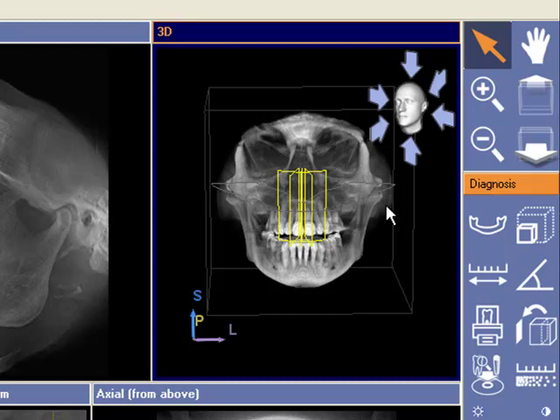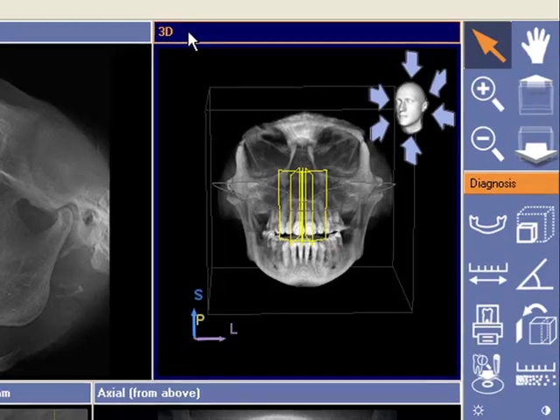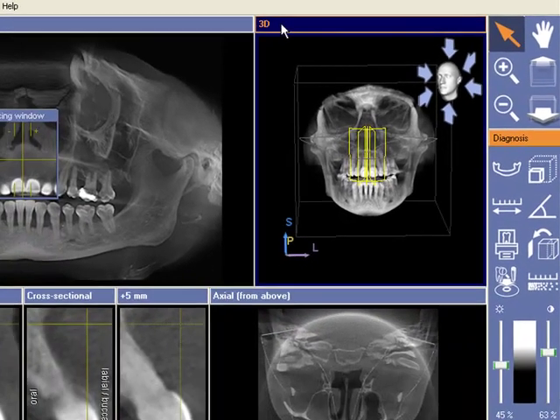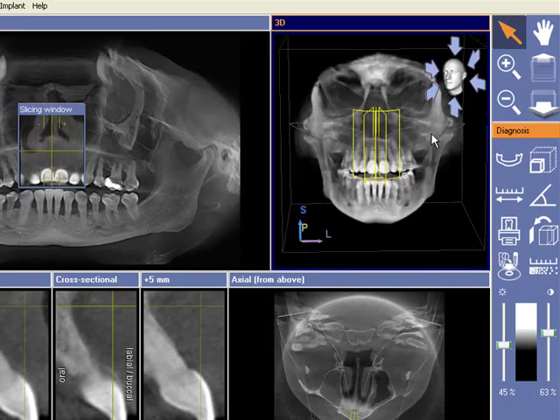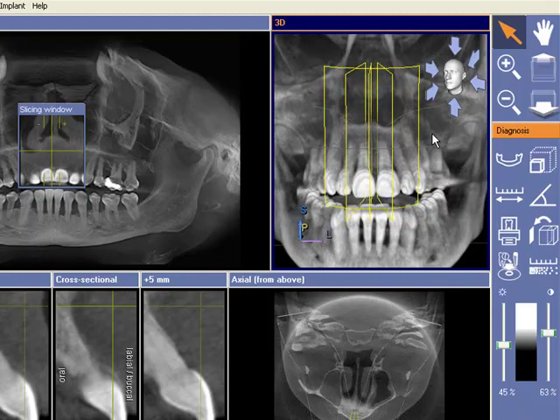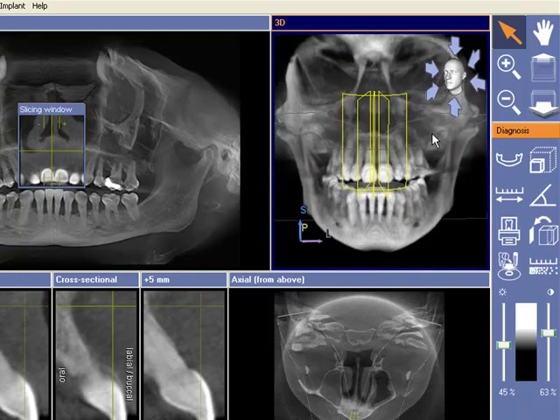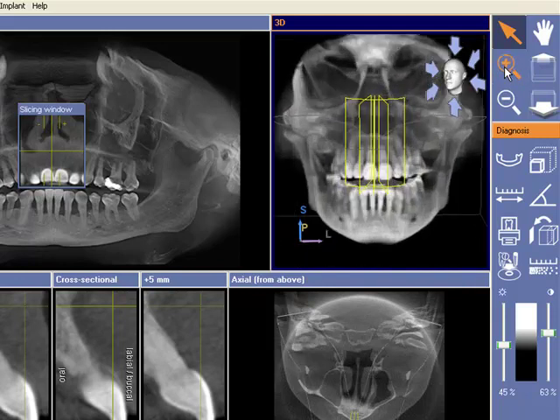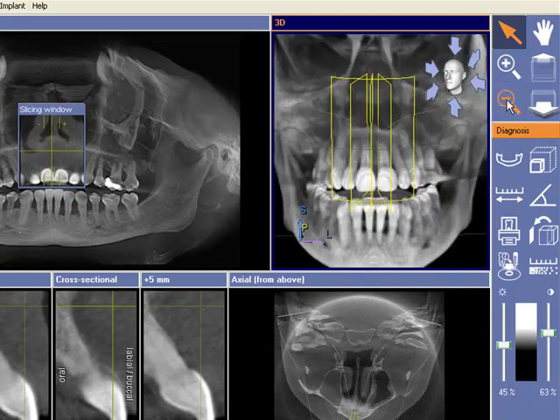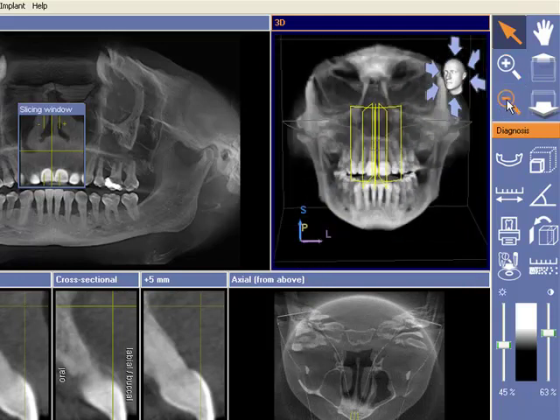All you would do is highlight the window you'd like to zoom in on — here it will be orange and dark blue. You scroll forward to zoom in and scroll backwards to zoom out. You can also use the plus to scroll in and the minus to scroll out.